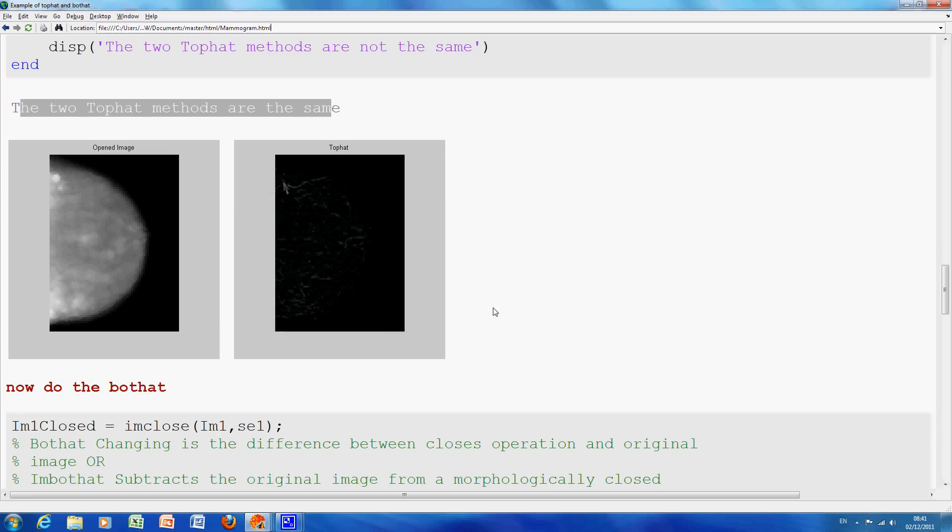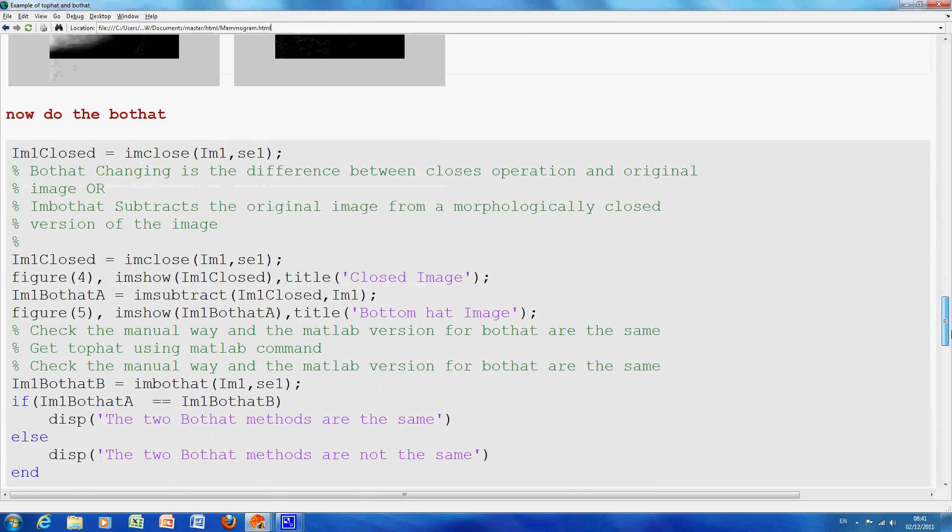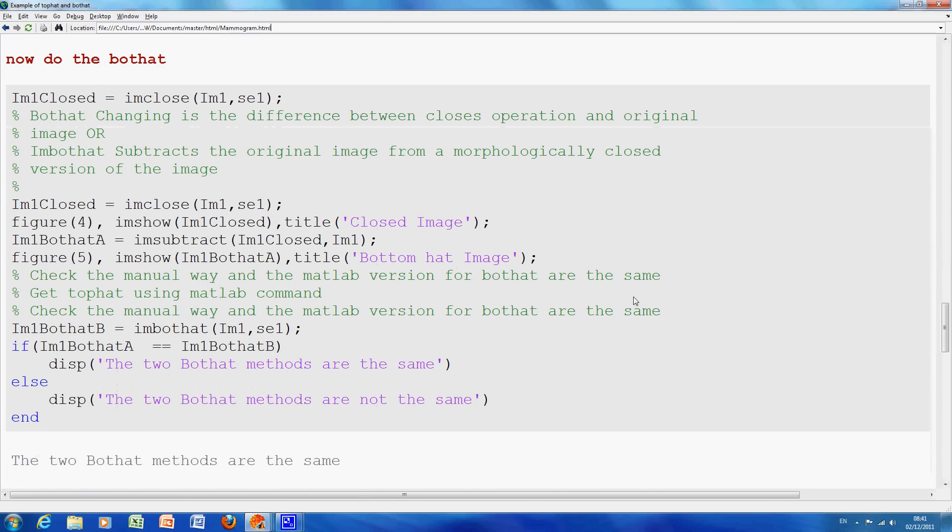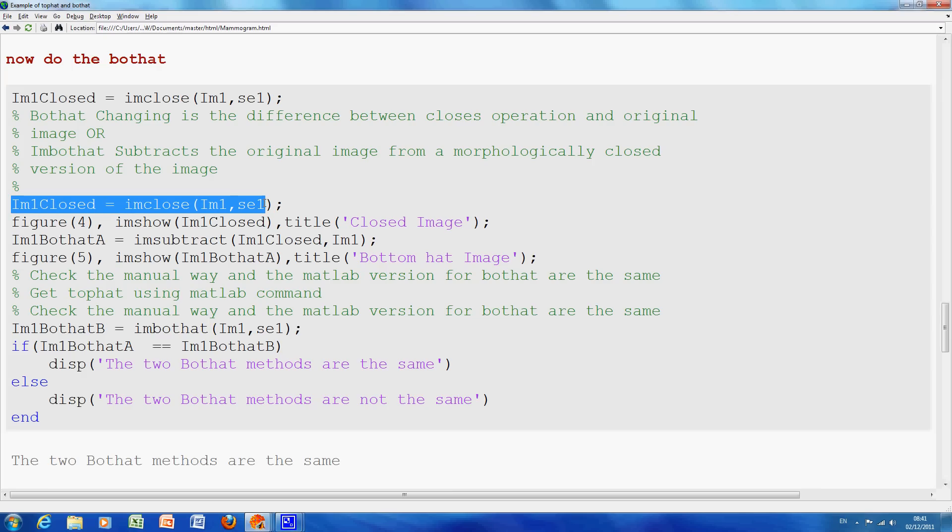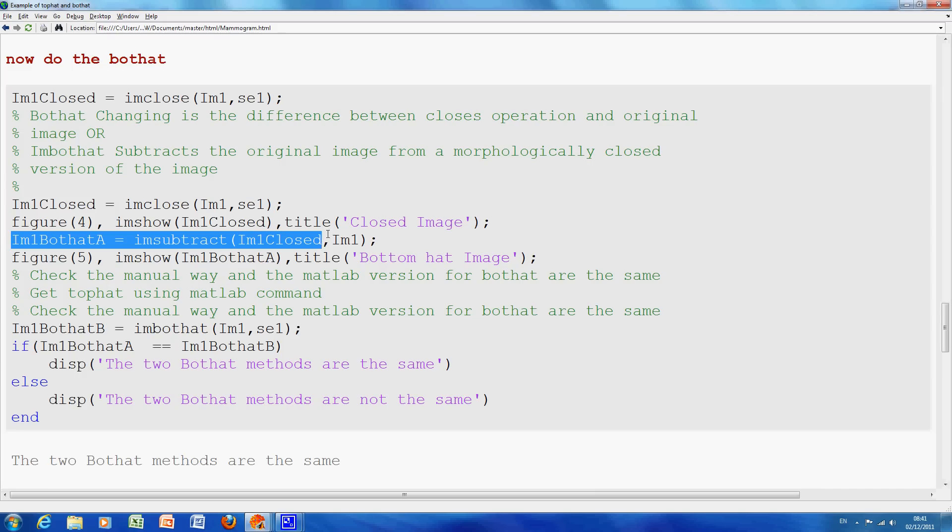So, we go back to, now we're going to do the BotHat. And the BotHat, what do we have to do first? We do the closing. I did the closing there. And then we say it's the closed minus the original. And that will give us an image. And when we look at that in a second, that will represent the intensity troughs.